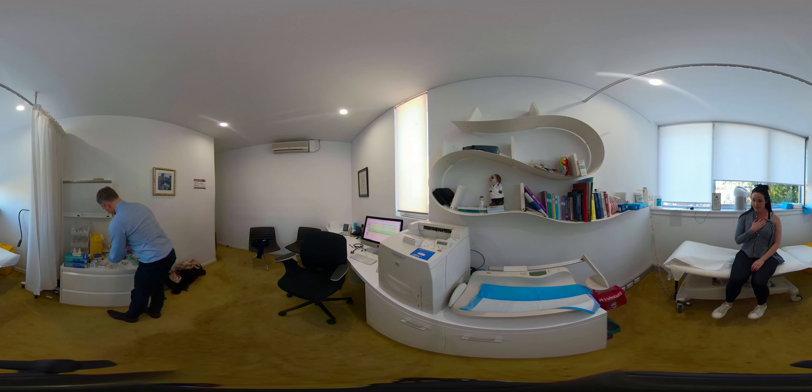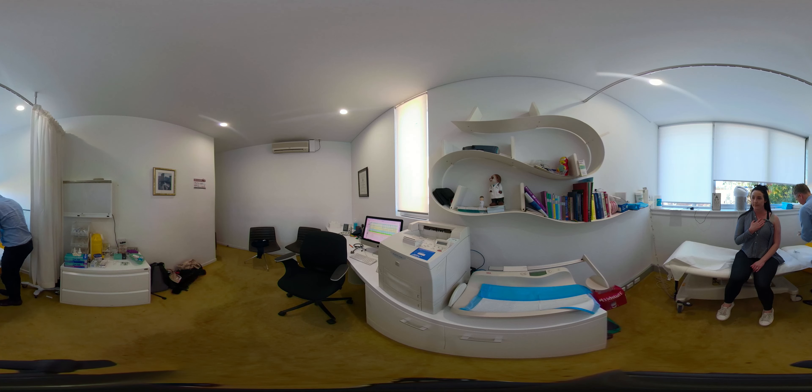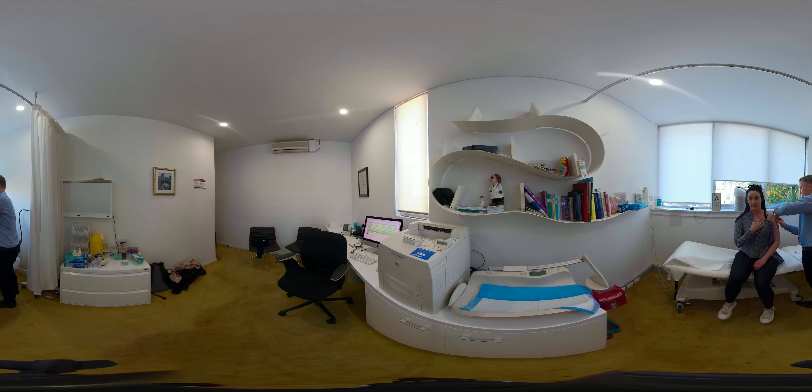I'll just have a little sit up there. So this will be a little bit cold, but then you'll feel a bit of pressure where it's poking in. This will just distract everything, so when I do the needle, you shouldn't feel anything at all.